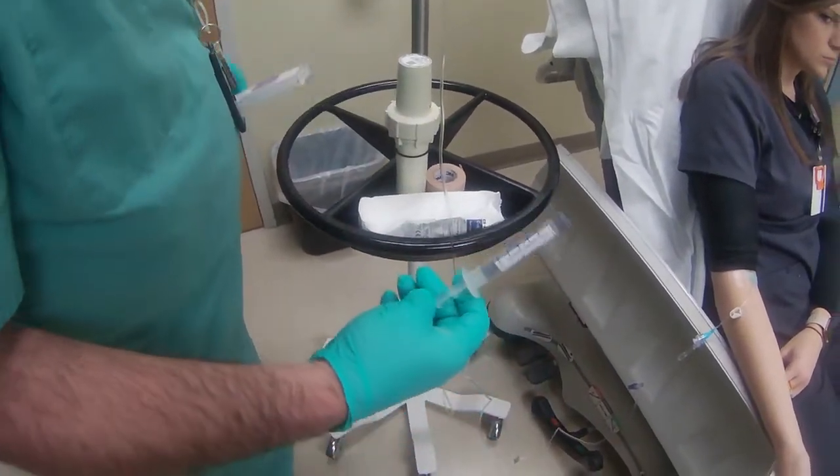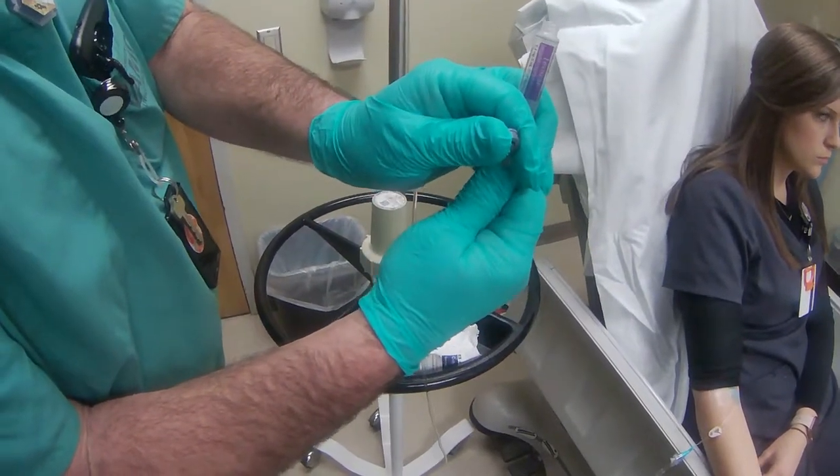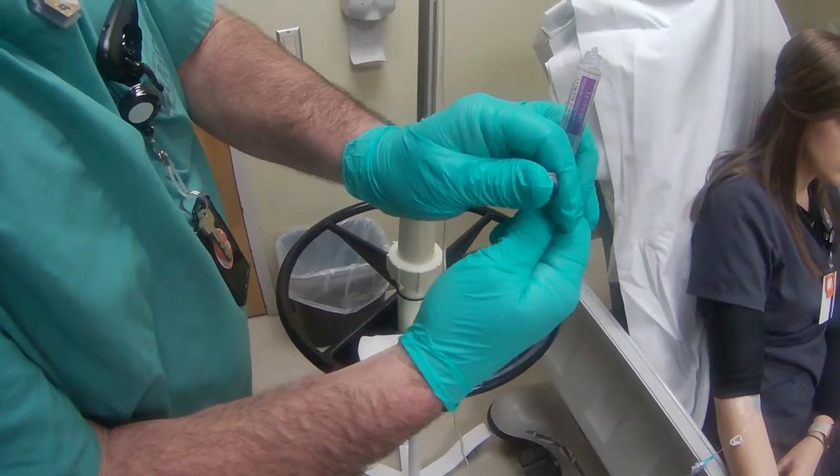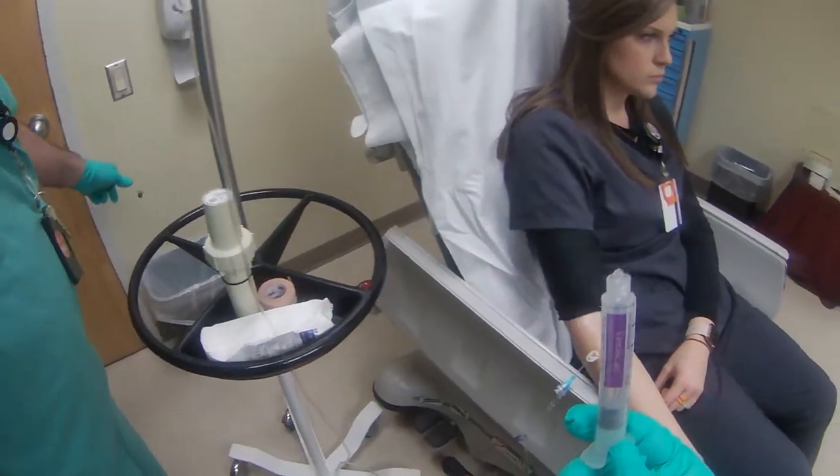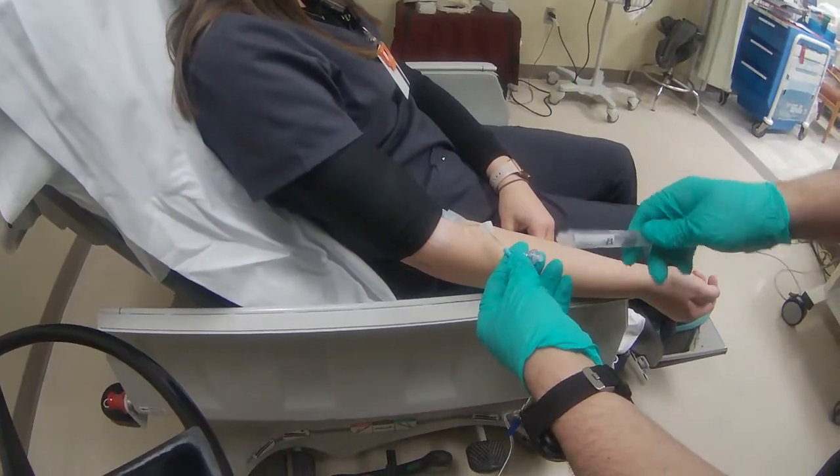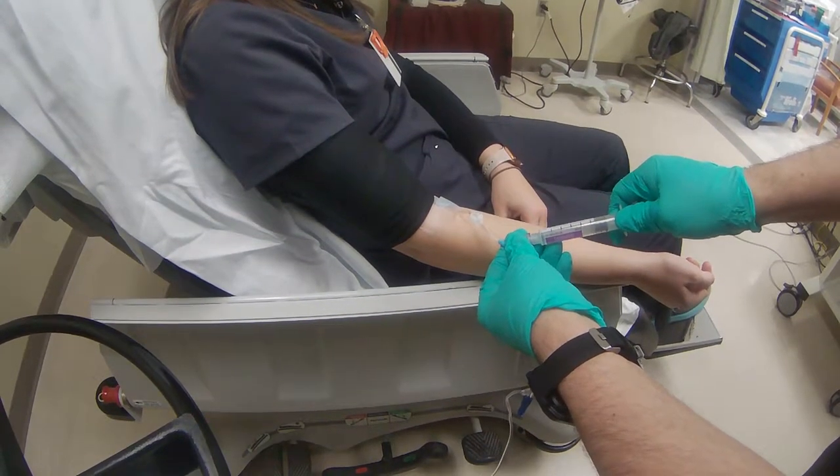Will pull it out and then we'll have to prime it. After it's primed, you will give it to the physician. And to do this, I usually connect it, I take out some air.